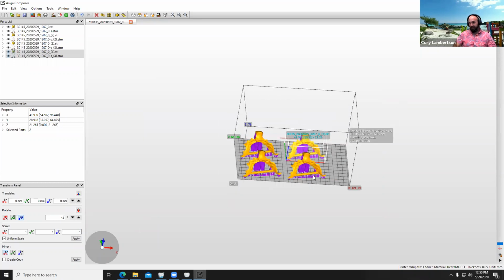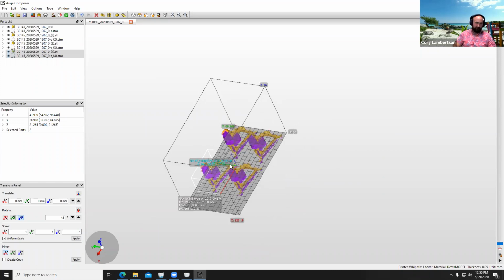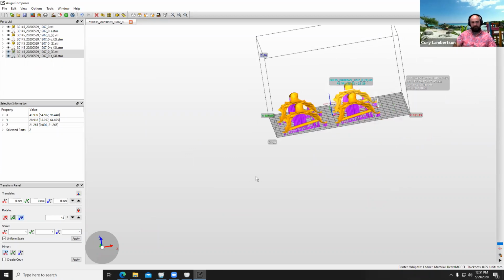With that, you could do it for Halloween or whatever. You could actually print one out of like a black resin. Yeah, that'd be cool. But why would you do that? You already have a missing tooth.